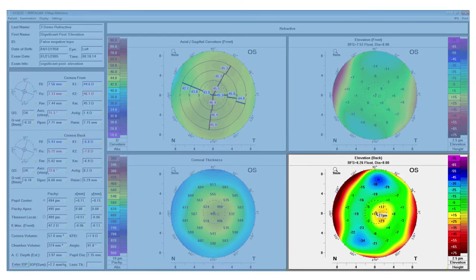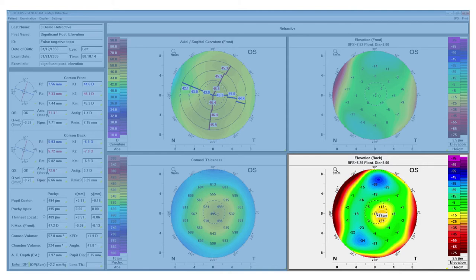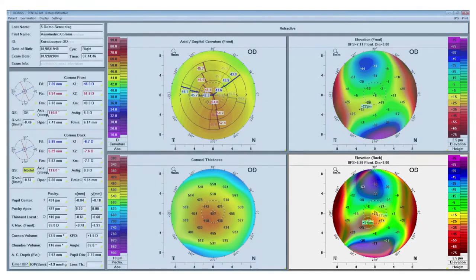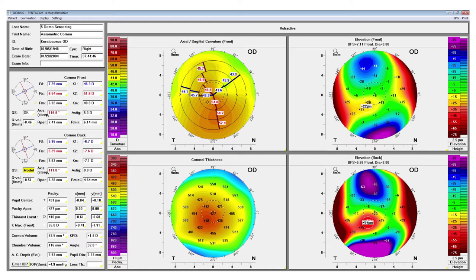Here's an example of a patient with early ectasia. What we see here is central island of elevation on the posterior elevation map. This is something that you would not be able to see on an anterior surface topographer because this is happening early and it's only seen on the posterior surface. Here's an example of a more advanced keratoconus. We see asymmetry on the curvature map like you would expect, abnormal anterior and posterior surface elevation, and a thin cornea.